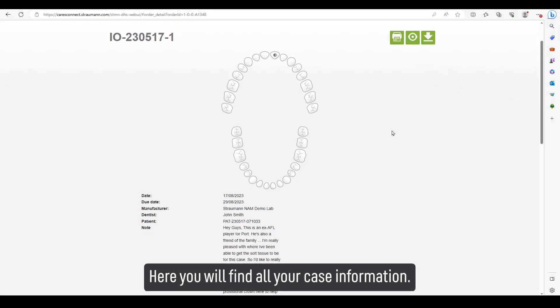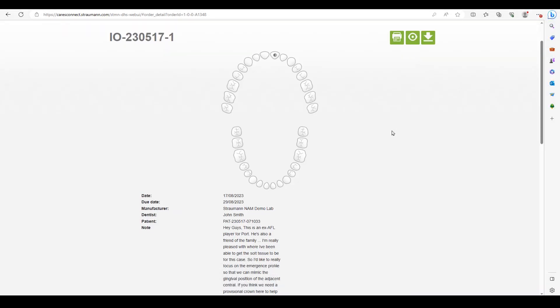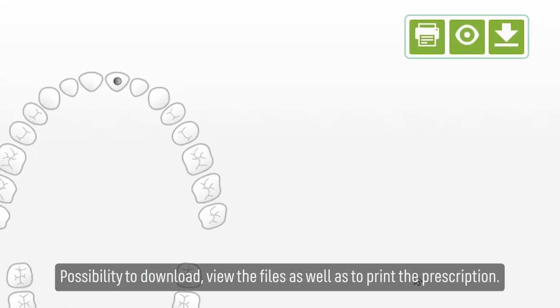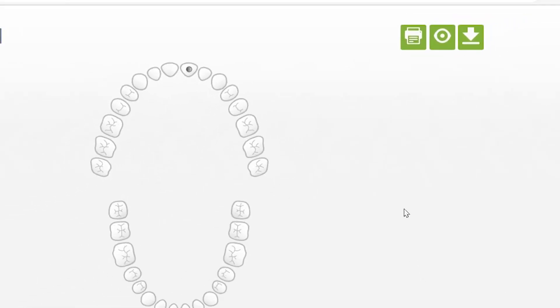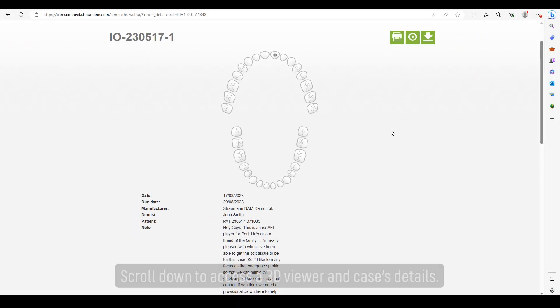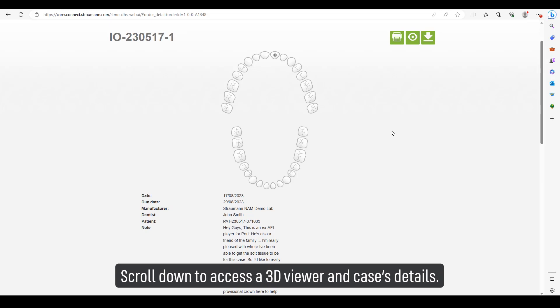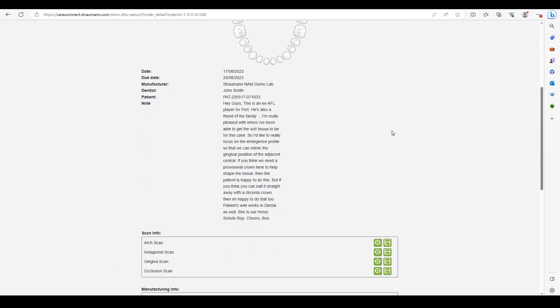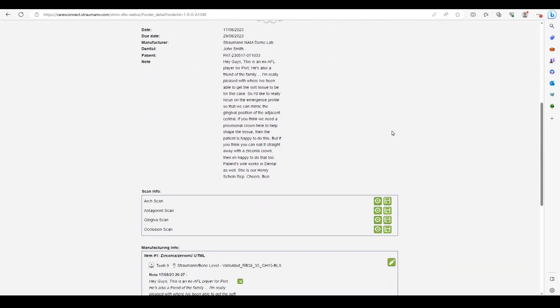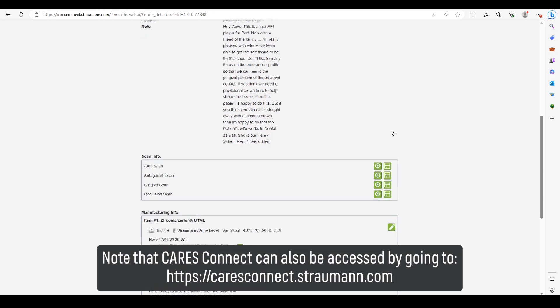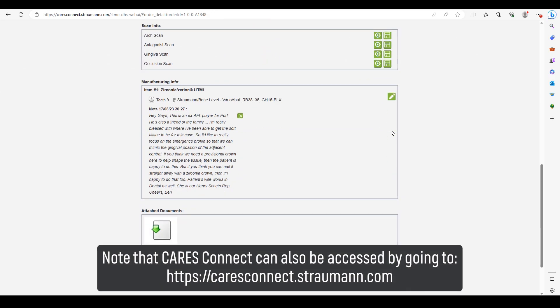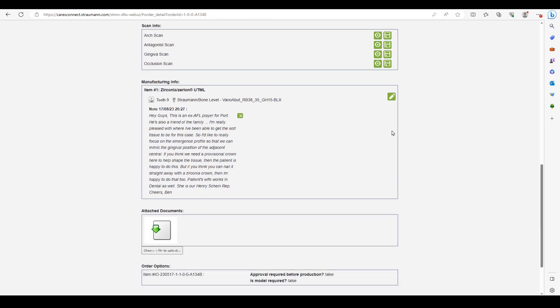Here you will find all your case information, with the possibility to download and view the files as well as to print the prescription. Scroll down to access a 3D viewer and case details. Note that Cares Connect can also be accessed directly by going to caresconnect.straumann.com.